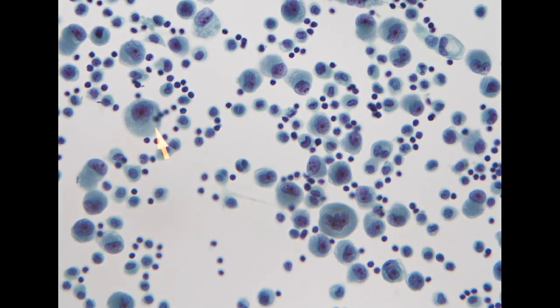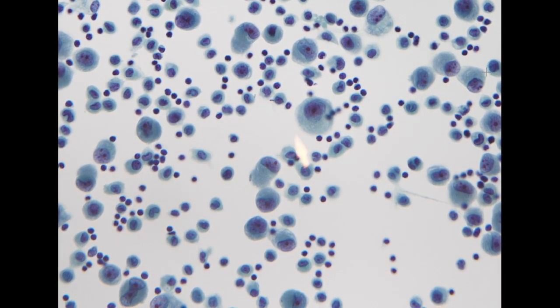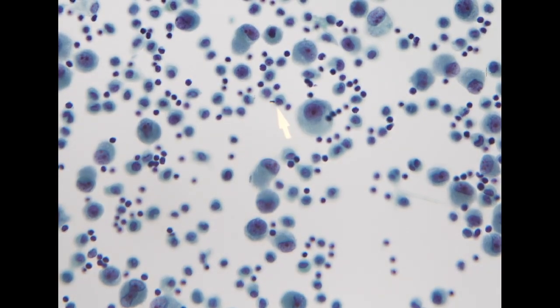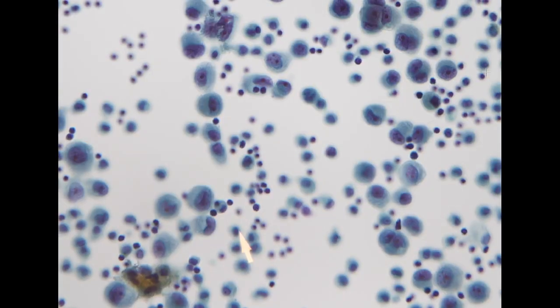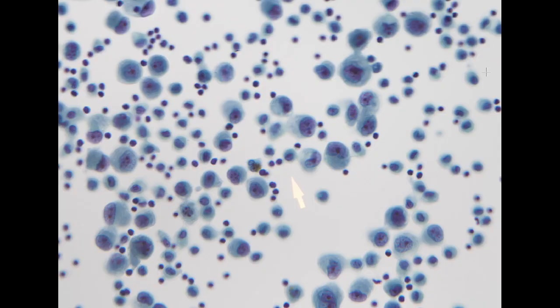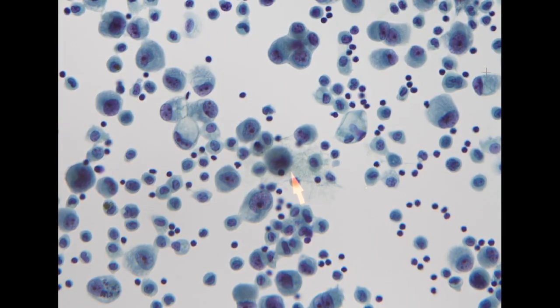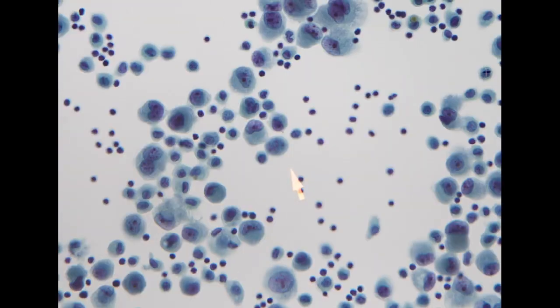However, in this case, it is very apparent that the size of the nucleus is already more than 4 or 5 times bigger than the adjacent histiocyte. So supposedly, these are all cancer cells because reactive cells cannot develop this size of nucleus. And scatteredly, you will see some very coarse chromatin and prominent nucleolus, so this is compatible with metastatic adenocarcinoma developing this poorly differentiated single cell pattern.